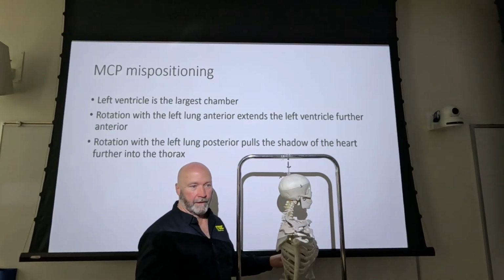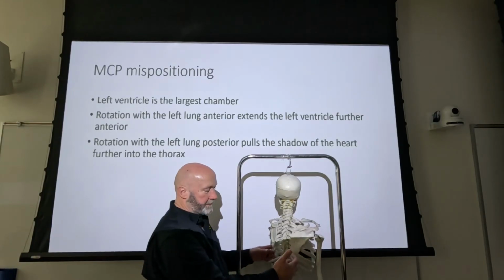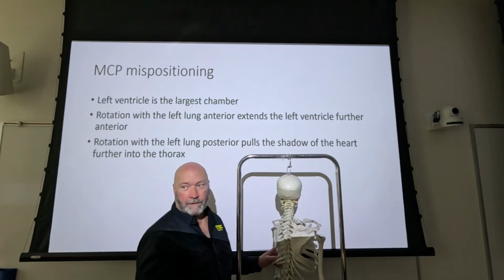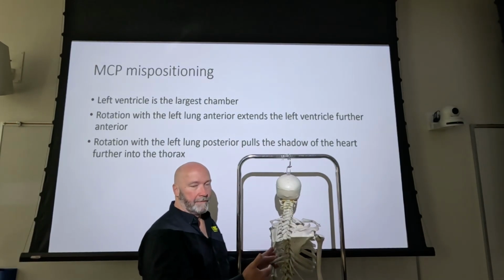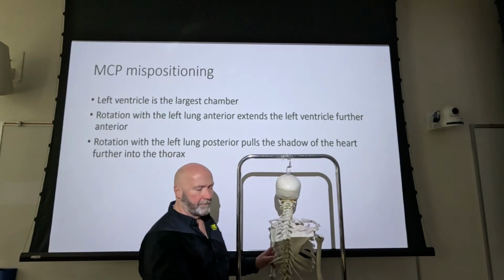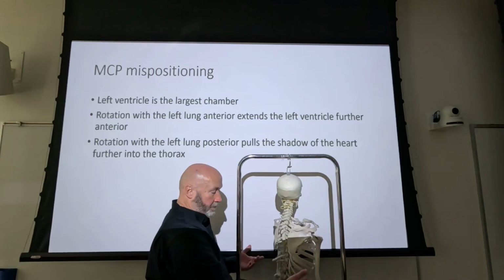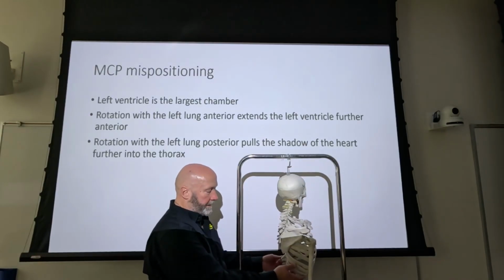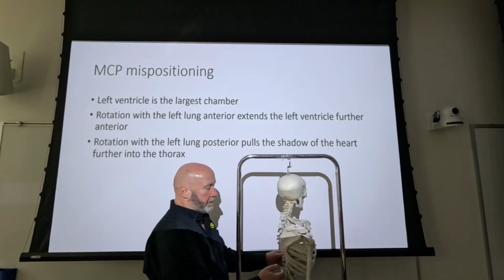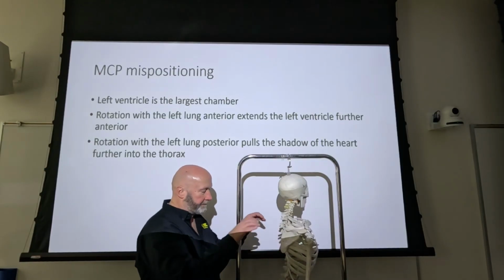You overcorrect, right? So as you rotate back, the amount of rotation is exactly half of what it looks like. So even on one that you would repeat for rotation, the amount of change that you would need to make on your patient is half as significant as what it looks like, right? So don't overcorrect. Look at the gastric bubble. Where is the gastric bubble? If it's posterior, then you rotate it. And what we need to do is rotate the left side anterior and the right side posterior in order to correct that. The hemidiaphragm should be superimposed.